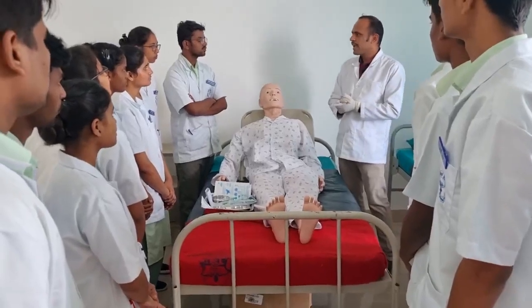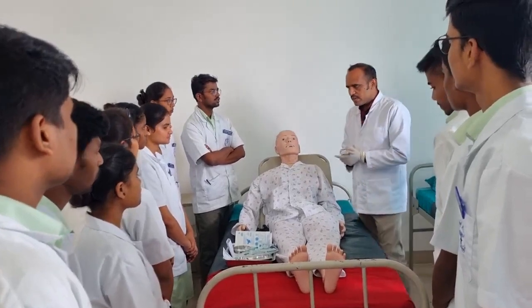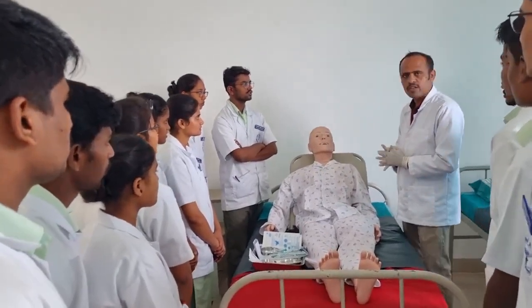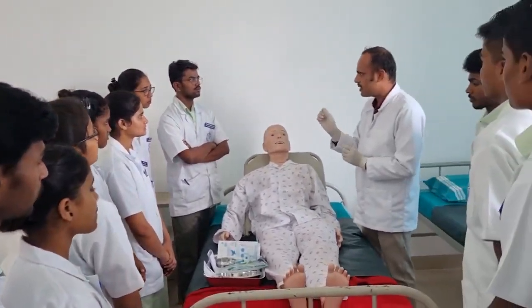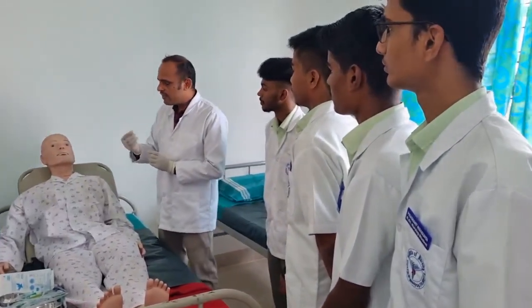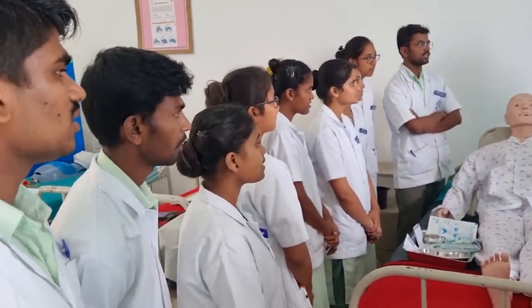Discuss regarding the NG tube feeding. Regarding that NG tube feeding, there are two processes which come. One is gastric gavage and another one is gastric lavage. When we are going to feed the patient, that term we will call gastric gavage, and when we remove the stomach content from the stomach, we will call that gastric lavage.